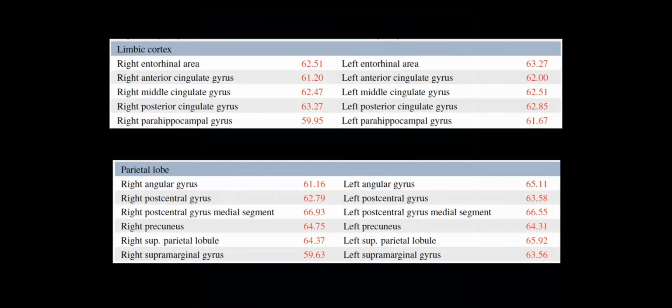And we can see in this individual that we can not only identify brain age on the whole brain level, but we can look at individual brain areas and again, ask and answer the question, is there abnormal aging in particular areas that, for example, might be vulnerable to Alzheimer's disease? And the answer is absolutely, there's a higher chance of that. For example, look at the entorhinal cortex on the left and on the right. The entorhinal cortex is the gateway to the hippocampus. It is the earliest affected area in Alzheimer's disease.